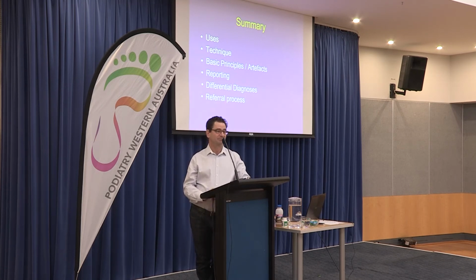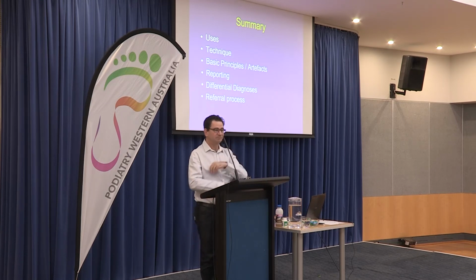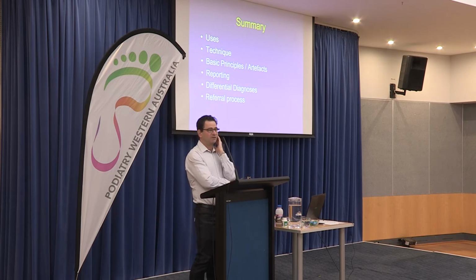I haven't really got questions, but I thought it was quite interesting when you were talking about patients needing a visual to help educate them. So I started using a simple Doppler when I do a neurovascular assessment, and I tell the patient what I'm going to look for, and once they see the biphasic, they are eager to see what the next one's going to be.